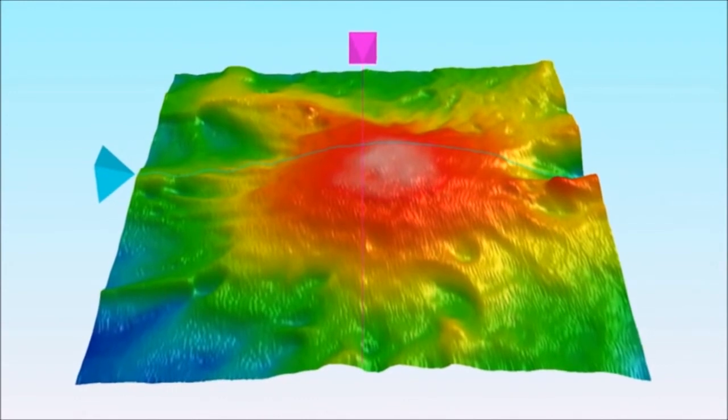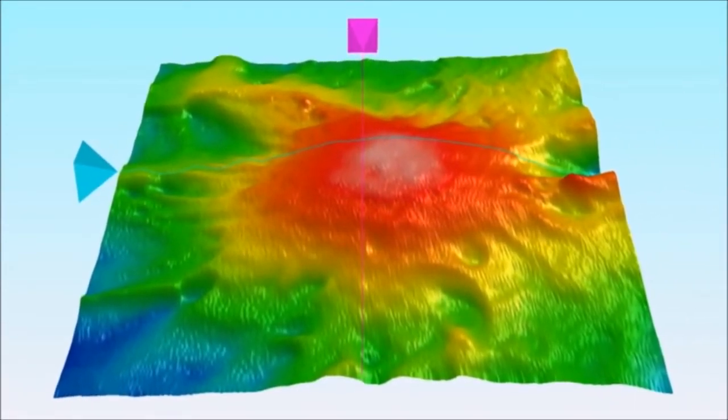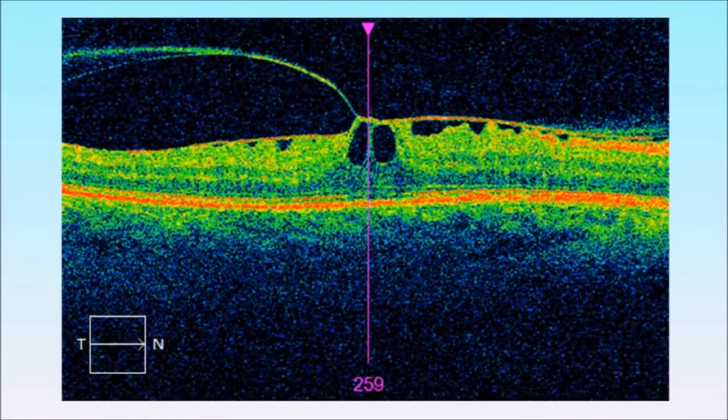This patient, shown in the next two images, has developed an epiretinal membrane on the retinal surface. As the membrane contracts, it causes distortion and cysts of fluid to form. This requires urgent surgical intervention.